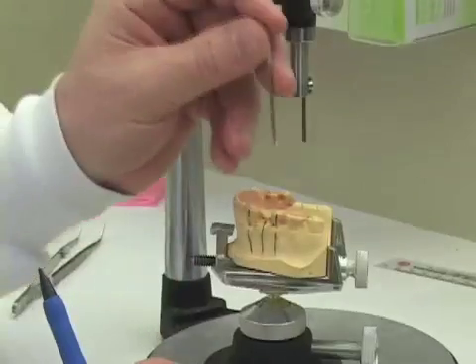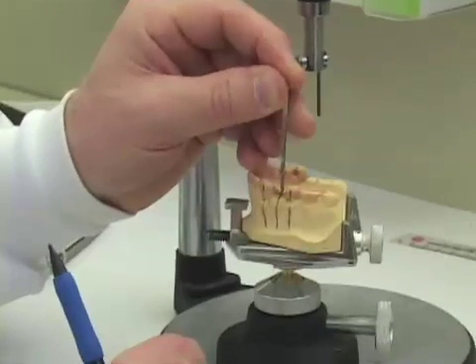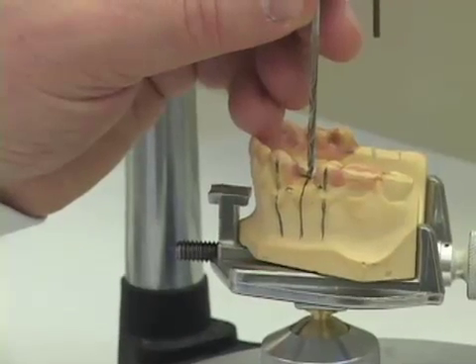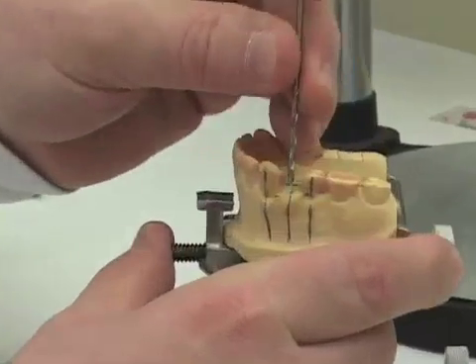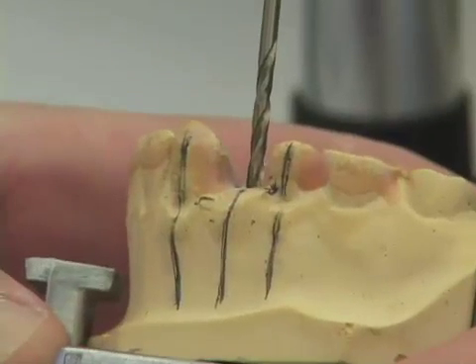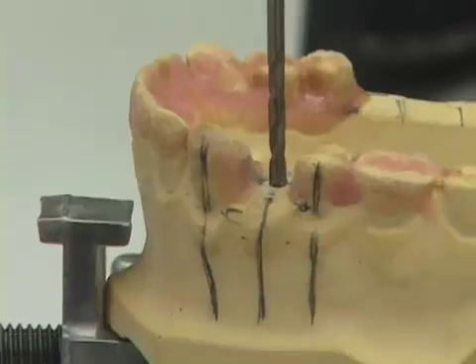We're going to place the surveyor table on the drill press and use the drill press to drill a hole in the appropriate location and orientation for our 2.2 surgical guide. Off-camera, we used a drill press to drill a 2.2 millimeter diameter hole in our cast at the orientation and location we had determined for our implant placement.